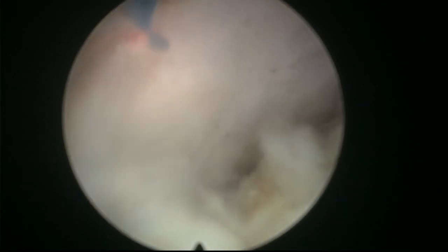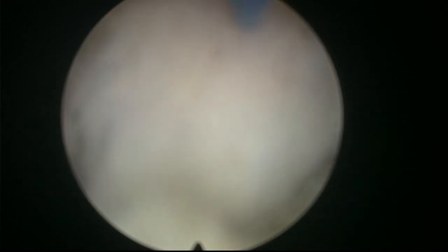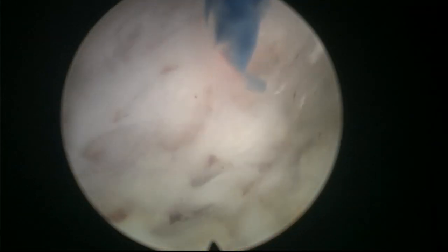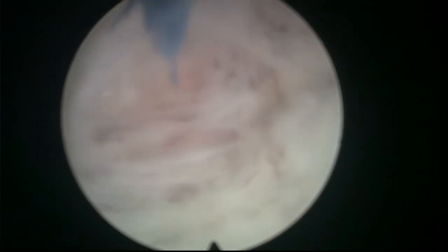Here is 12 o'clock. There comes a moment when we are going to find the bladder neck itself. In this moment, when we come to the bladder neck, we have to cut the bladder neck circumferentially. The plane is detaching very nicely. Let's see where we are — this is nice. I'm trying to record the whole procedure so we can send it in better quality if you want, and the representatives from Richard Wolf can give it to you.